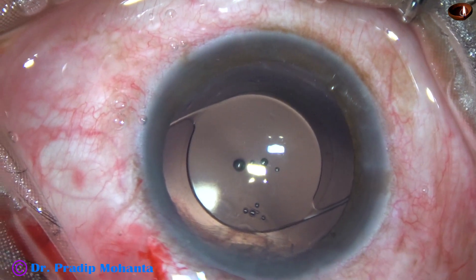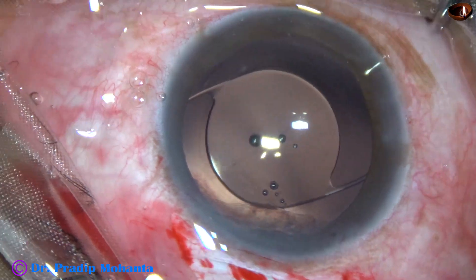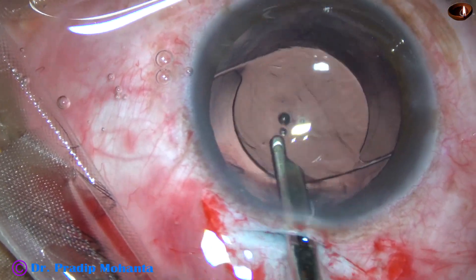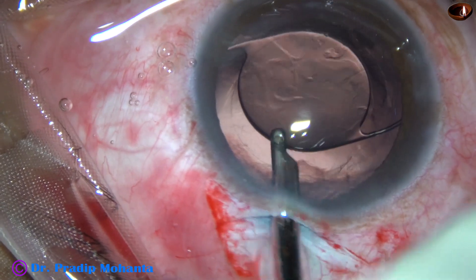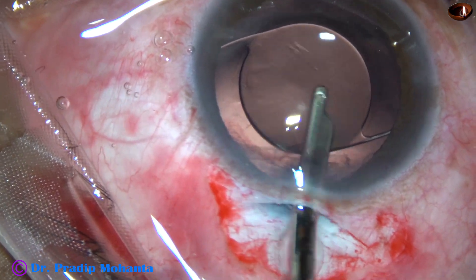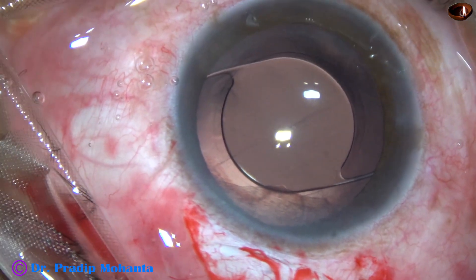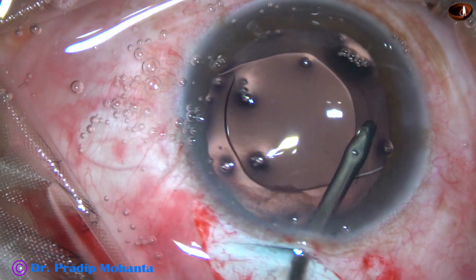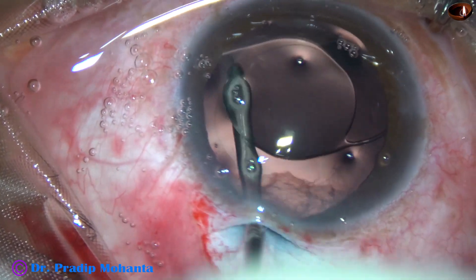The visco has to be removed very nicely using the 23-gauge Simcoe. The anterior chamber is irrigated first, then the capsular bag is also irrigated. Irrigation and aspiration of the anterior chamber and capsular bag are carried out together. Using the bimanual IA, further irrigation is done and hydro polishing of the posterior capsule is performed.